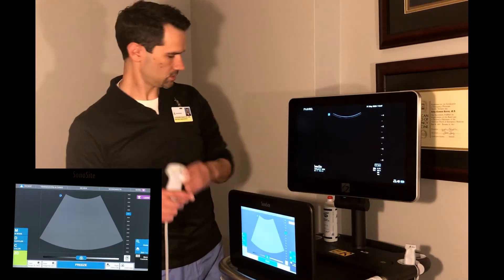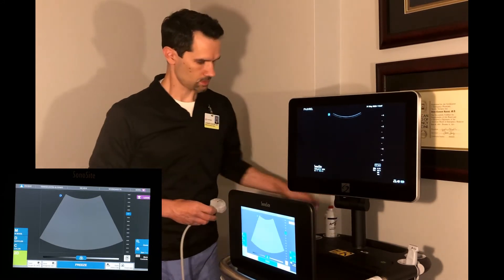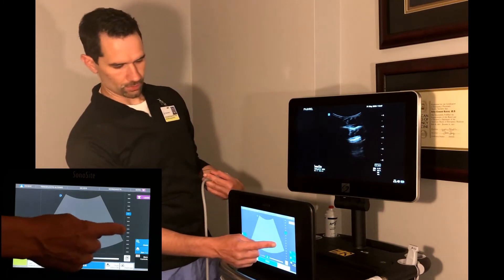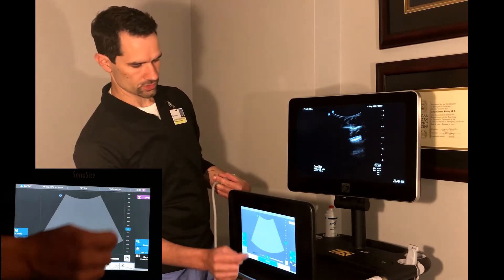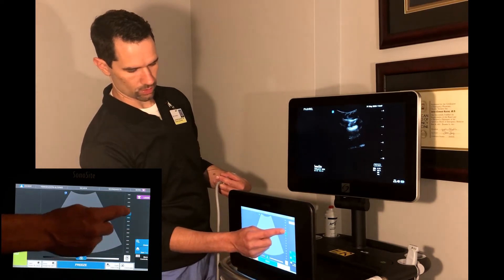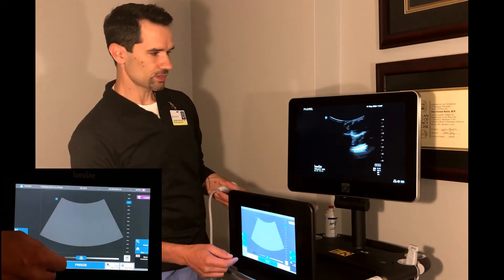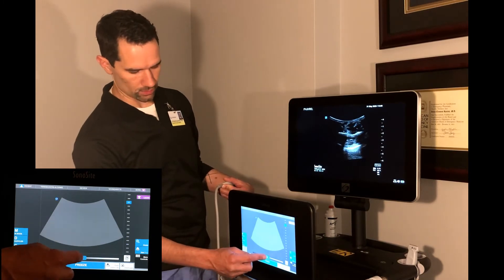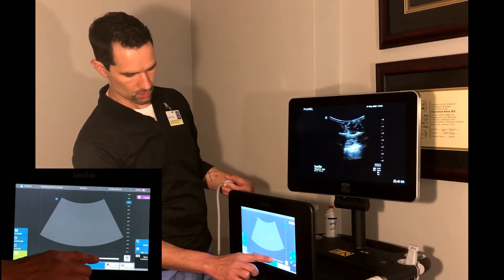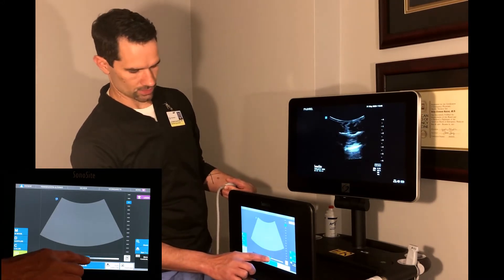When you're actually scanning, you adjust using the touch screen. To adjust the depth, slide the bar on the right of the touch screen to make the image deeper or more shallow by sliding it up. You can also just click on it. Same thing with the gain — sliding the bar below the image icon to the right makes the image brighter, and to the left makes it darker.